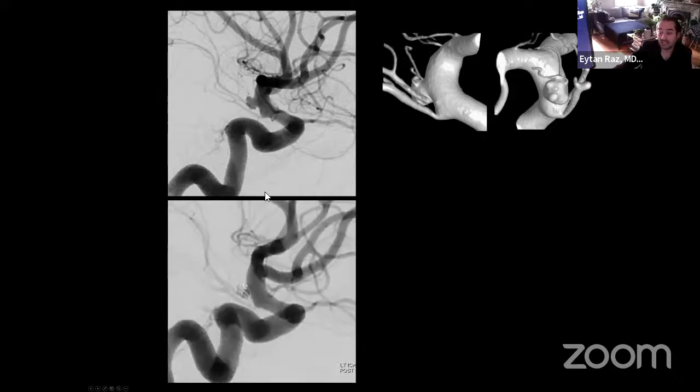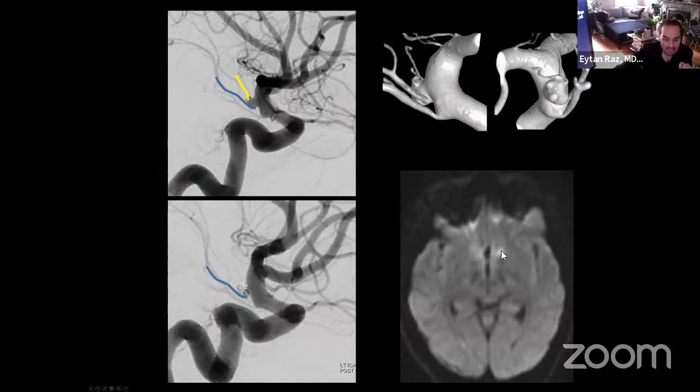So we coiled it and closed off, not an exceptional coiling, but enough to close off the part that really looked mostly regular. And we were happy at the end of it because the choroidal was open, and we didn't realize that perforator that was obvious with the post-processing we did later on. Now it's closed and you don't see it. Because of this, we got an MRI that proved exactly that: you had a little infarct in that perforator that you closed during coiling.